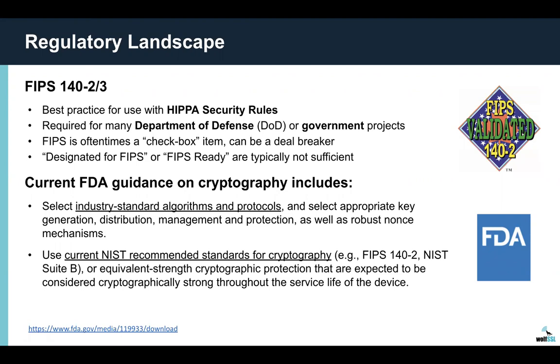FIPS is oftentimes really just a checkbox item, but it can be a deal breaker, which is something that's needed. And then some other terms are floating around, things like designed for FIPS or FIPS ready. These are terms that some customers like to try to use to meet a FIPS requirement. But since it's not actually a full FIPS validation, those typically aren't sufficient. And sometimes those can get flagged if an audit happens as well.